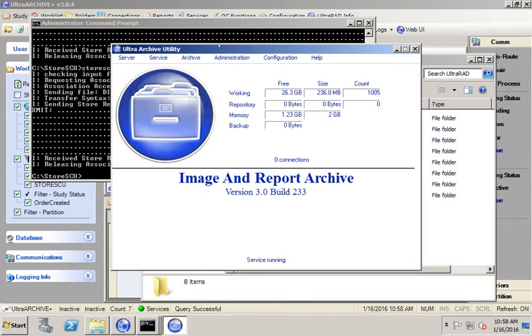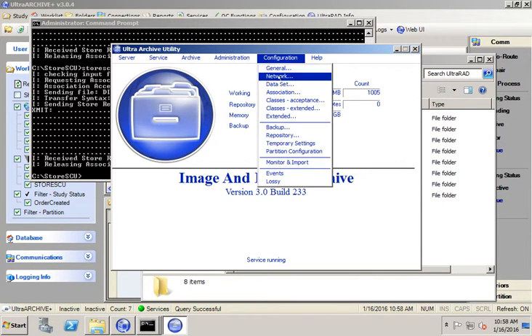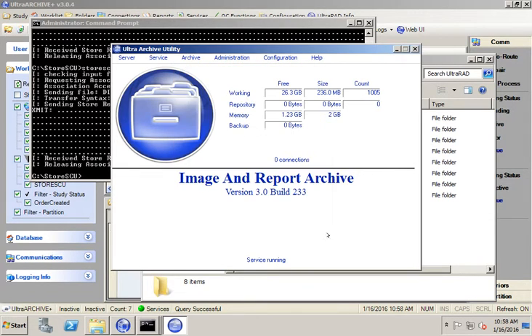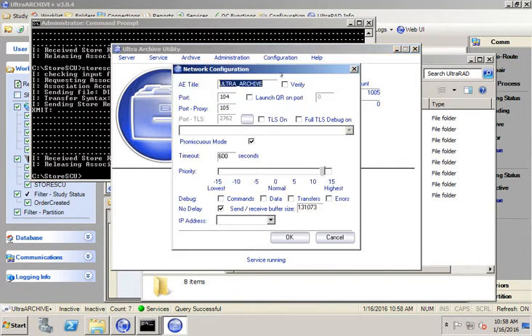However, it will zip the log files so as not to use too much space on your system. If I go back to the archive utility, I'm going to show you one more thing. You can see that currently the debug logging is turned on, and it is running. By default, if you restart or stop and start your service for UltraARCHIVE, so I'm going to stop the archive service, and I'm going to start it back up again. You'll notice when I go in the network, it automatically turned off all the TCP logging. So anytime the service is restarted, the logging will be turned off automatically.